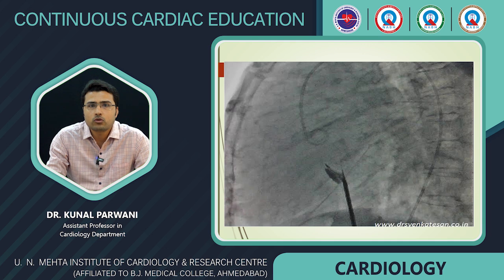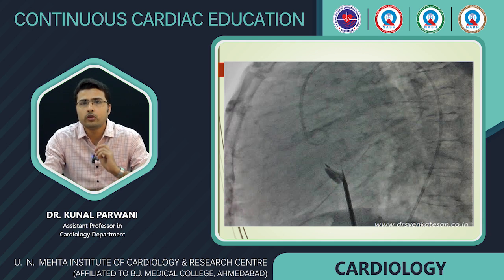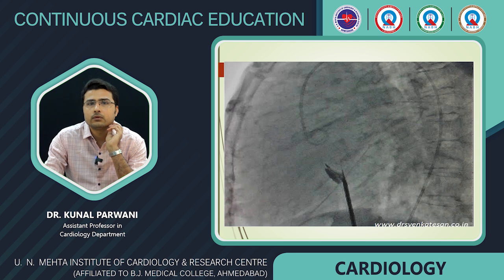If the puncture site is too low, it might produce a more horizontal septal stain.